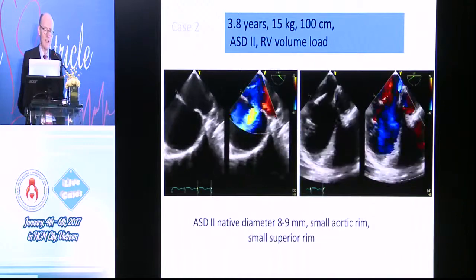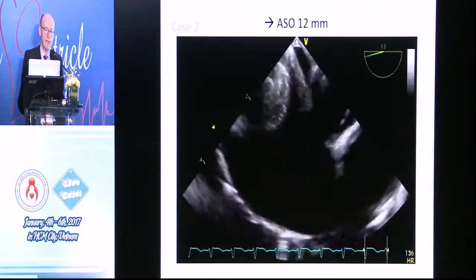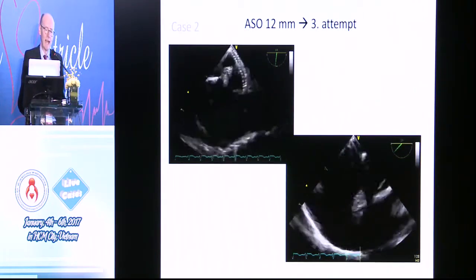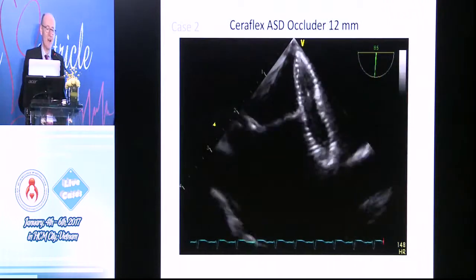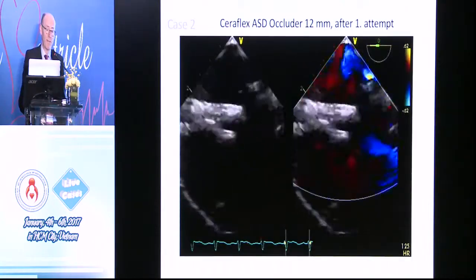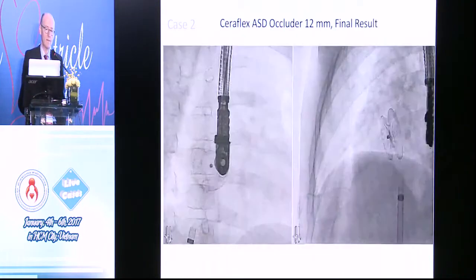Another case — small Secundum ASD, small aortic rim, small superior rim. Balloon sizing, 11-millimeter stop flow. A 12-millimeter Amplatser septal occluder really didn't align properly, kept coming through. We're all familiar with this button-holing approach, and on the third attempt it was still not really settling. So a 12-millimeter Seriflex was placed — this is how it settled, looks nice and flat — released with just one attempt. That's after the release, and you can see it doesn't really change position during the release at all. This case had only 1.2 minutes of fluoro.